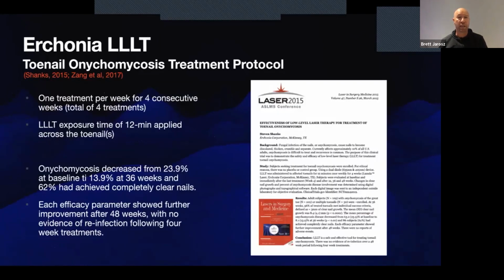Now, this one here, I've got a couple of cases going on with this myself right now. You can see here, for toenail fungus, the treatment protocol was 1 treatment for 4 consecutive weeks. So 4 treatments total, with an exposure time of 12 minutes, basically laser across the toenails. And this was done with a specific device, the Lunula device, which Reha Care has been selling. But again, it uses the exact same wavelengths that are in this. So you can use this exact device for this particular protocol. Again, I've got 2 cases of this going on right now. First treatment was last week. Second treatment was done today.